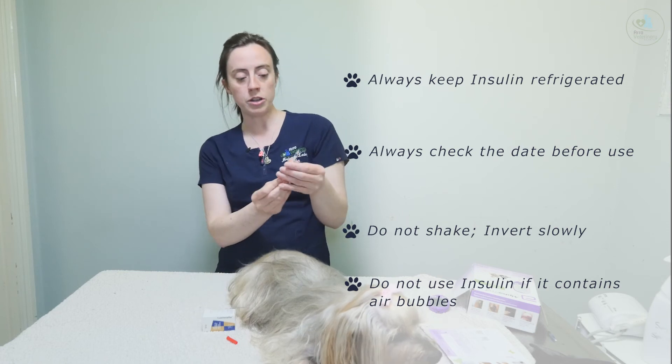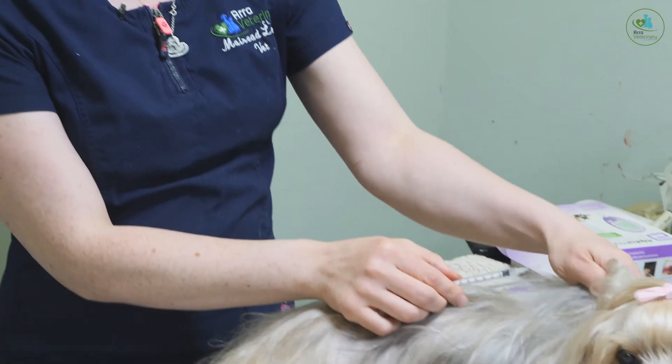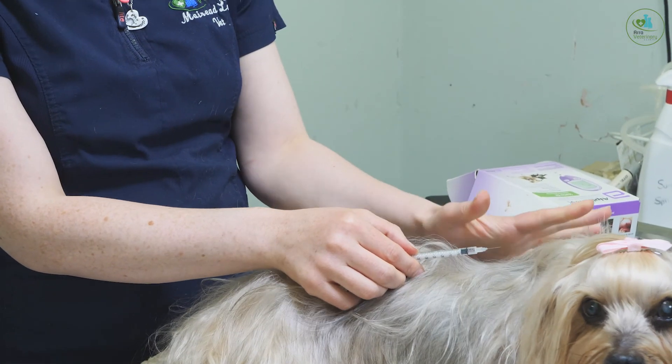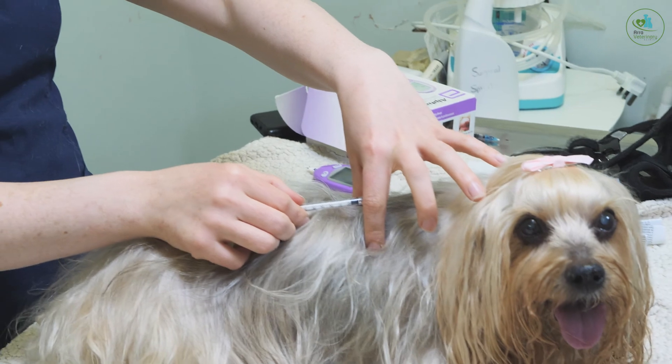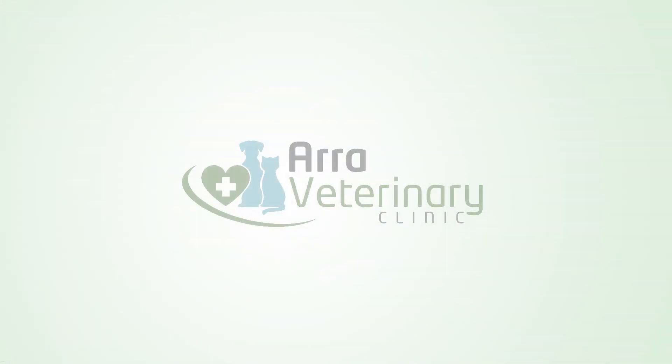So again, what you do is put your syringe in, draw back slowly, lift the skin. I always tell our owners to drop the skin again nice and slowly after you put the needle in, and then give your injection.